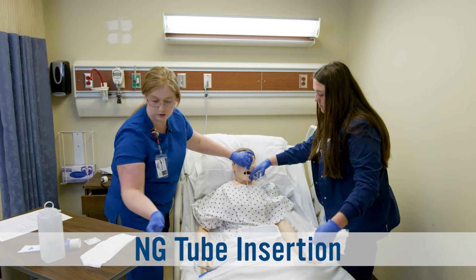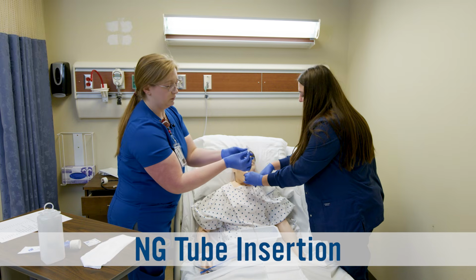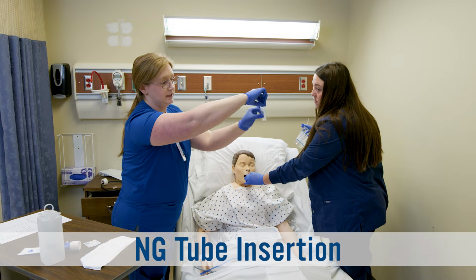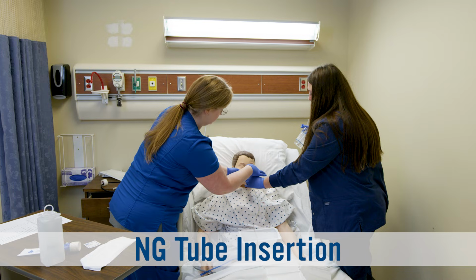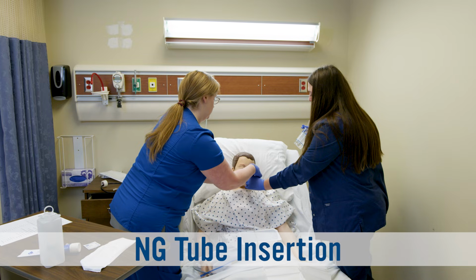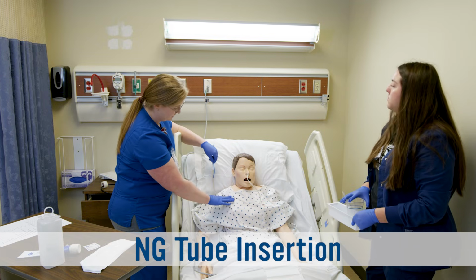Secure this in the nose so that it doesn't come out. What we want to do with the tape, thank you for holding that, is what we call pants the tape. So you're going to rip it just part way down so it looks like two little legs. You're going to go ahead and put this part on the nose and take the two tinier strips and just wrap it around the tube. Okay, so it's nice and secure. With this, you want to pin or tape this to the patient's gown.